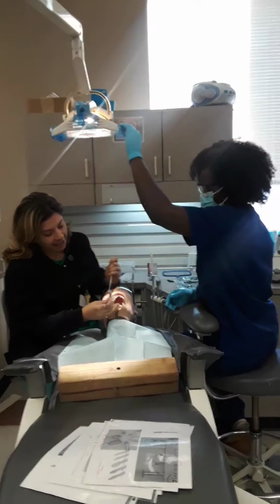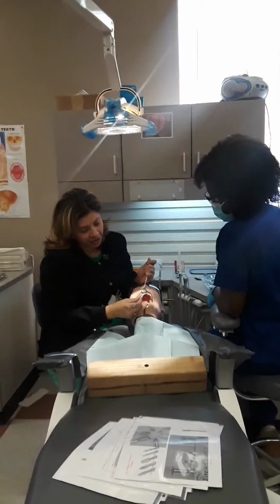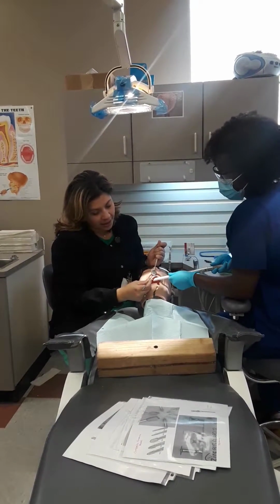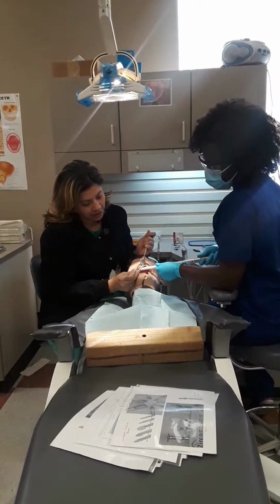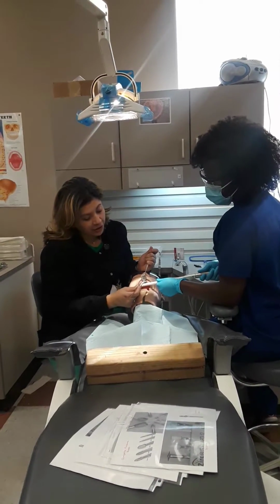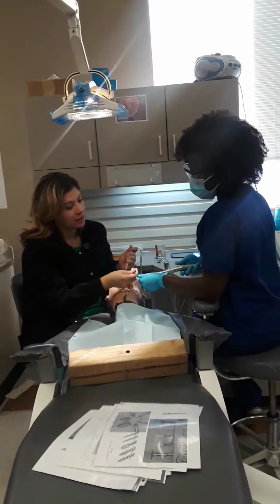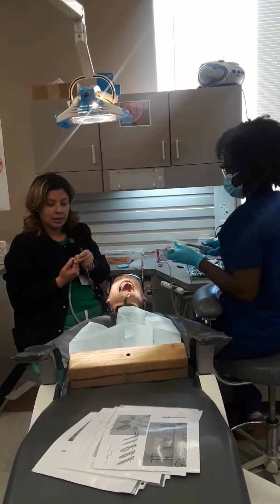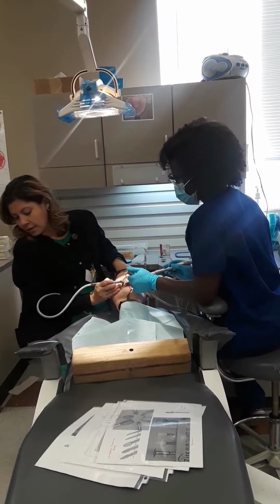All right, then she passes me an explorer after I have placed my material and cleaned it off, because I want to make sure I have no excess. I'm also going to see where I'm going to trim, if I need to trim. If I have any overhang, check my filling for hardness. I'm checking all of that right now. I got a little bit of overhang right here. So since I have an overhang, I'm going to use a finishing bur, a flame, because it's going to go into that gum, but it's not going to cut the gum. So take that back, change my handpiece, change my bur to a finishing.